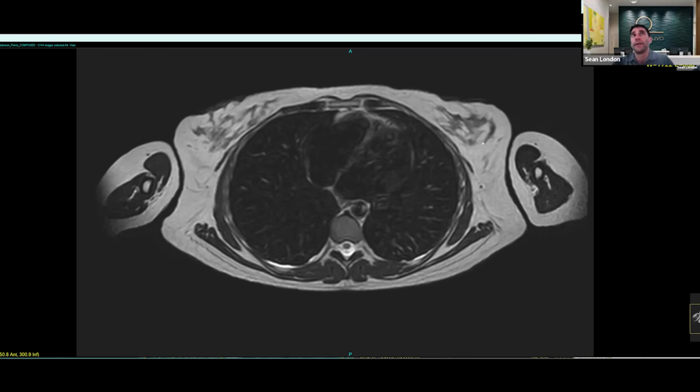But ultimately, I think all modalities complement each other, the imaging techniques, and I still favor all of them in our context because there are things that I can't see that other ones are going to pick up. And we do work with a lot of physicians that seem to alternate between these different modalities for breasts: ultrasound, mammography, obviously, and MRI. Yeah, and ultrasound's great, particularly when you're doing interventions, and there's no radiation. But people at high risk tend to alternate between mammography and then dedicated breast MRI every 6 months.